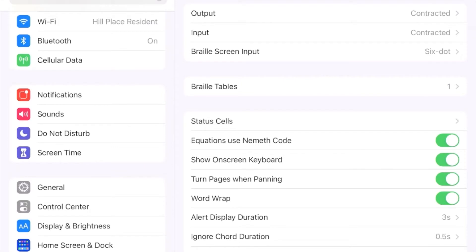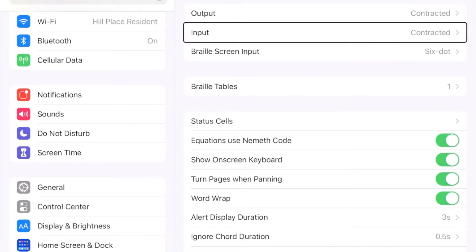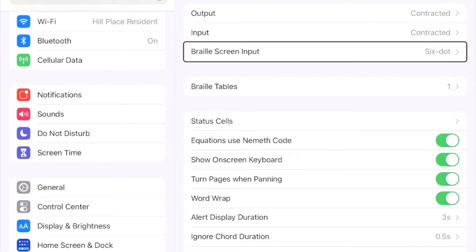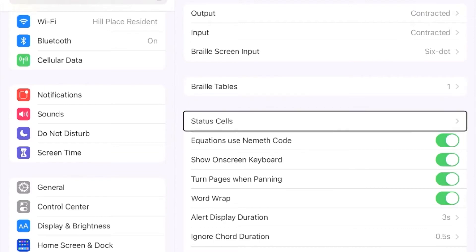This is where you'll find the settings for your Braille display. I'm going to swipe through and briefly explain everything. Output is the Braille code your display will output. Input is the Braille grade used when typing in a text editing field. Braille screen input pertains to Braille screen input, covered in another video. Braille tables shows the table it uses. Status cells allow your display to show status information like battery level on either end; I keep this off to have an extra Braille cell for reading.